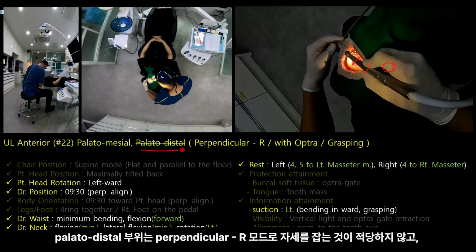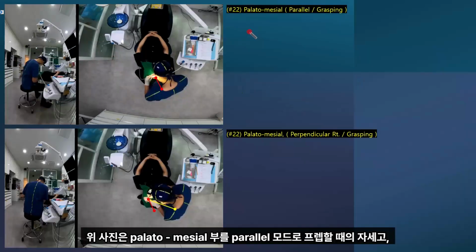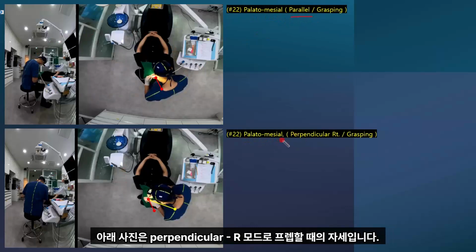The palatal distal area is not well suited for the perpendicular R mode. Instead, the perpendicular L or parallel mode is more appropriate, so we'll omit covering it at this time. Now, in this slide, the top photo shows the posture for prepping the palatal mesial area in parallel mode. The bottom photo shows the posture for doing a prep on the palatal mesial area in perpendicular mode.